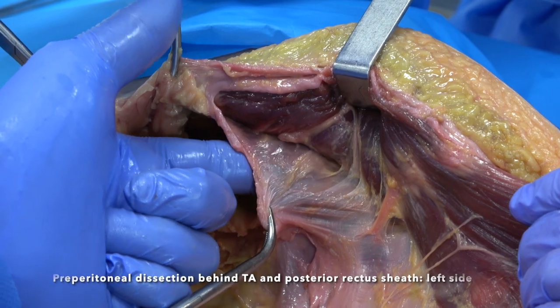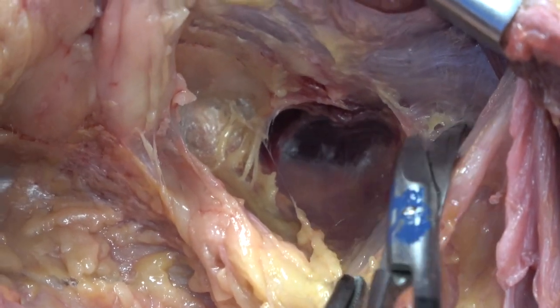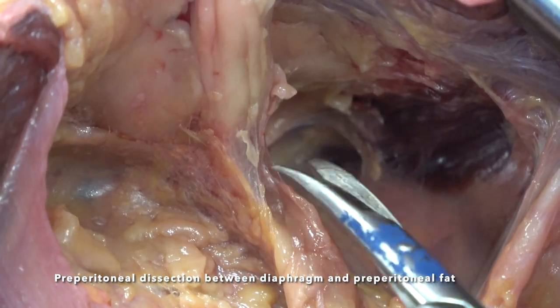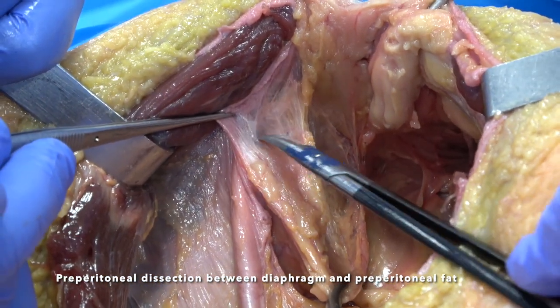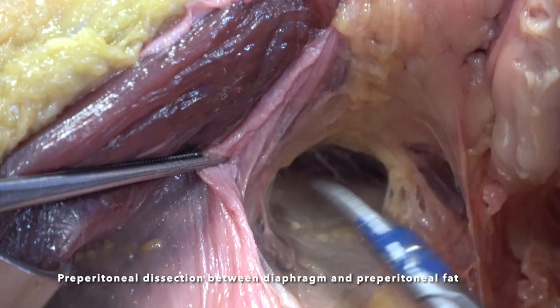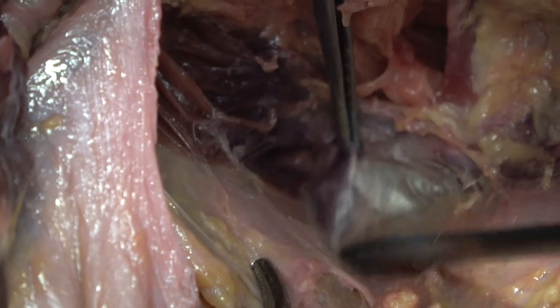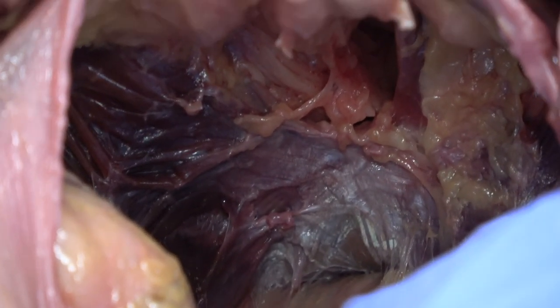We like to perform this dissection laterally first and then in the midline, leaving the fat pad attached to the xiphoid. Two constant vessels on both sides of the xiphoid are easily controlled with conventional electrocautery in real patients. Taking advantage of this periperitoneal fat distribution at the epigastric area, we extend cranially and laterally the space between the periperitoneal fat and the posterior rectus sheath. In cases where the peritoneum is too thin, we can also dissect a step up between the fascia transversalis and the transversus abdominis, which comes very medially at this level — a pre-fascia transversalis layer. Here we remark that the posterior rectus sheath insertion is preserved on both sides and the fatty triangle of Conze is dissected following the shape of the trident of the periperitoneal fat.